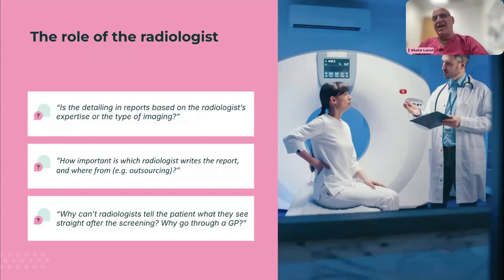So that is important to be done by the radiologist who's done the scan and reports it at the same time. For other images, I think it's best that the specialized radiologist reports the imaging. Then you're going to get a more specialist type of report. That's going to be more useful. I'm not saying that non-specialist radiologists can't do it, but I just think you'll get a better view of it from that point of view.